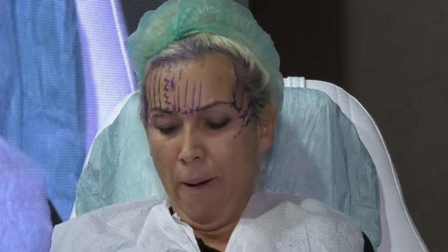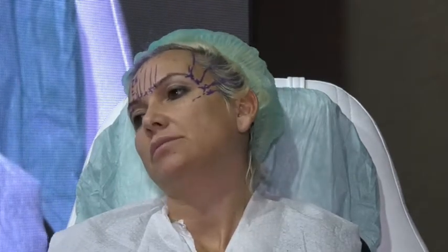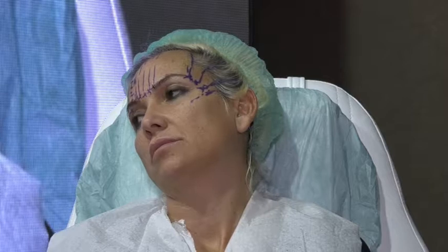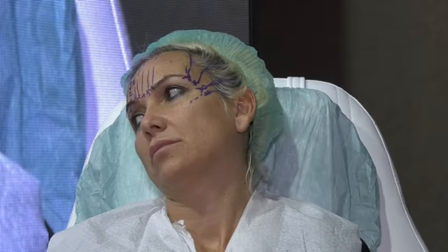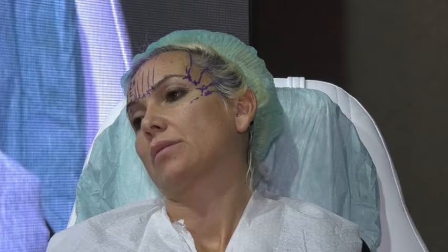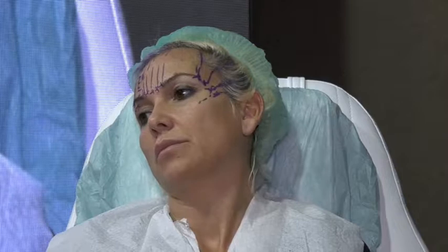Cases of alopecia are not affected by me. I never reach the hair follicle because I'm always subcutaneous. Scars for what? I don't exit. There is no exit. This is a cannula thread. You insert, press and go up. There is no exit, only an end point, a fixation point. Come on, we go to the second zone.